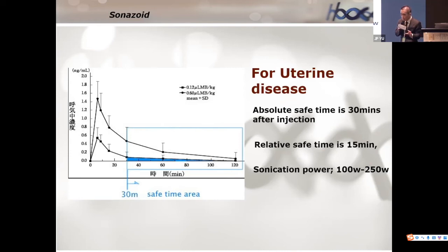No, the reason is when you don't use Sonazoid, the power is higher, and the time you take to treat is also longer. Why is it shorter and faster with Sonazoid? Because of cavitation. It's the cavitation effect.